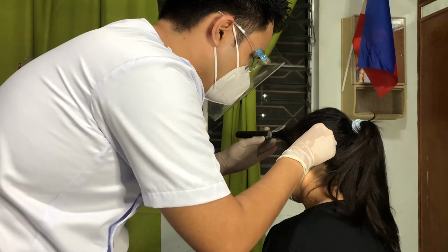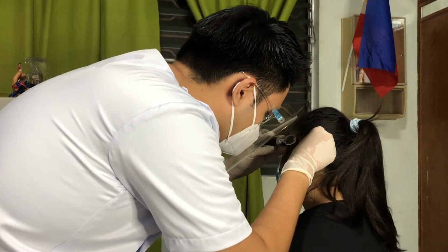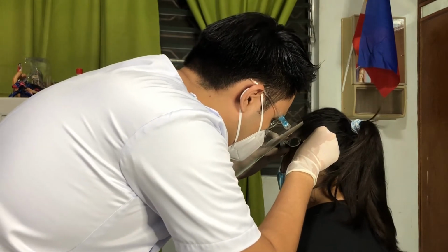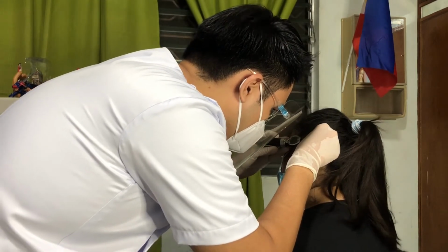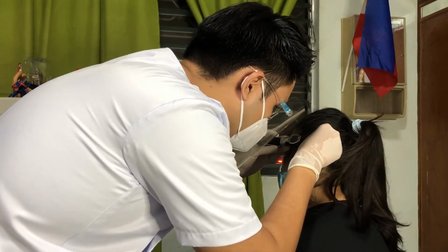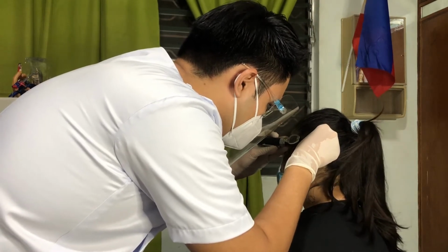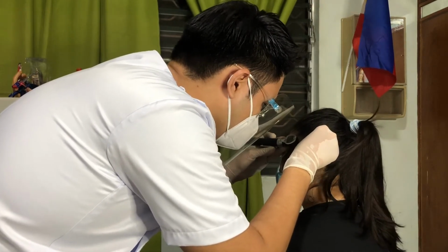Turn on the otoscope light. Grasp the otoscope with the dominant hand. In my case, I am a left-handed person, so I will be using my left hand. For cooperative patients, hold the handle of the otoscope in upright position. For the restless patient, hold the handle of the otoscope against the patient's head to help stabilize the instrument.